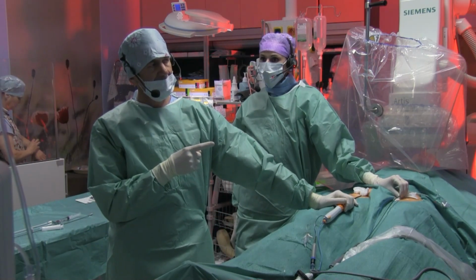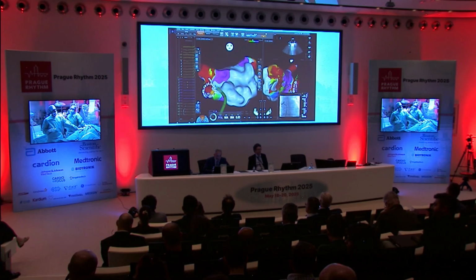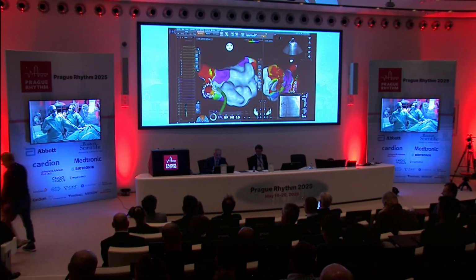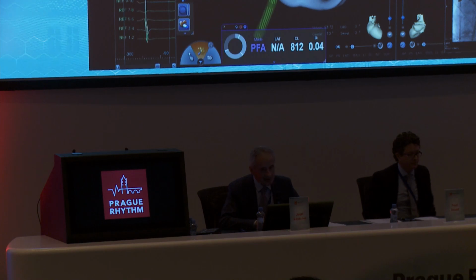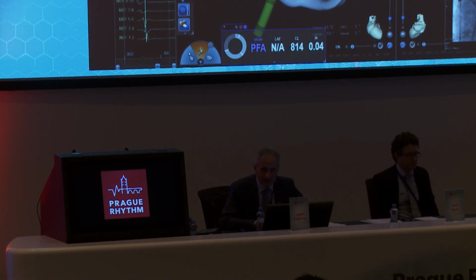Massimo, it's not yet proved that you increase the success rate. You increase the heart rate. That's proved. And for some of these sporty guys it might be detrimental because if you have increased by 10, they can feel it and even complain. We have one patient like that, he's complaining all the time.